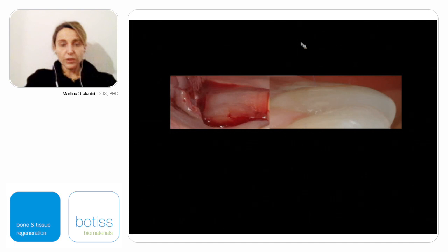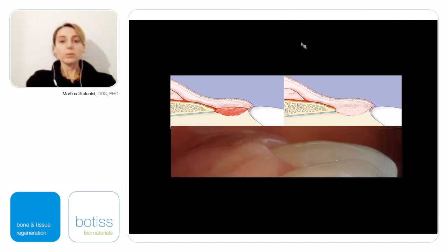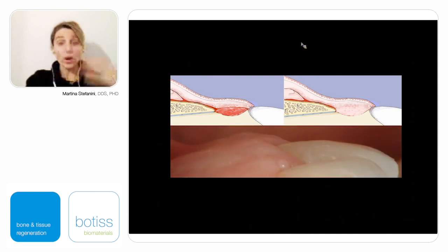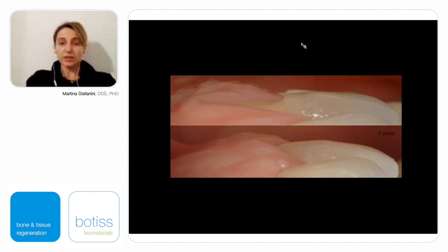are able to increase soft tissue thickness with time, because the collagen matrix represents a scaffold that will incorporate the blood clot that will remain stable above the root, and with time will become mature connective tissue, able to increase the thickness exactly 1, 2, 3 millimeters more apical with the gingival margin, where we need more thickness in order to reduce the risk of gingival recession recurrence.